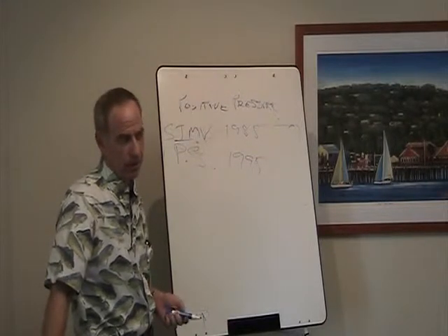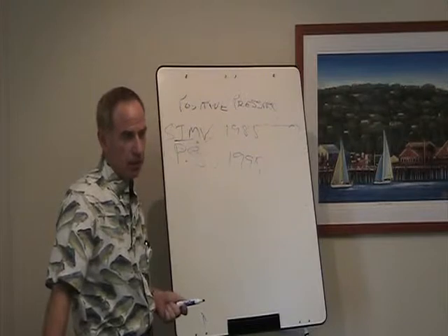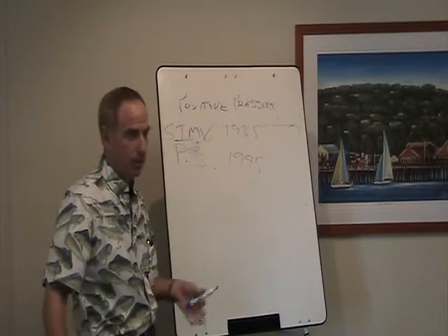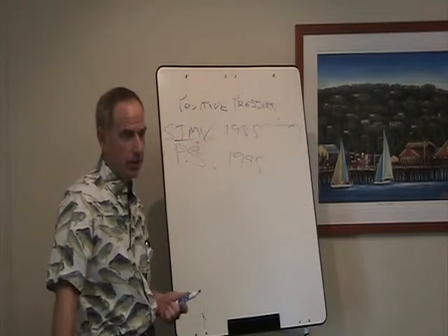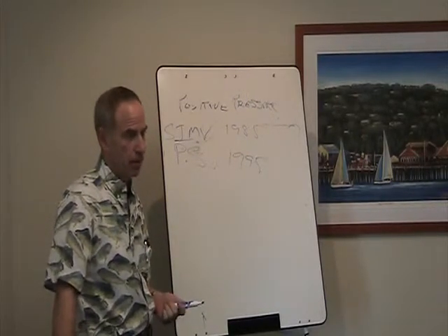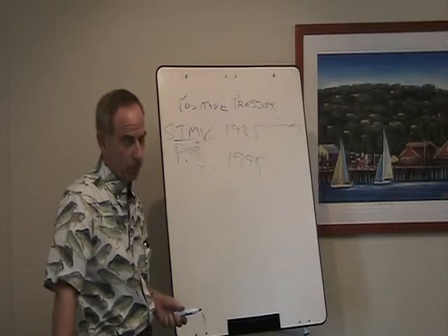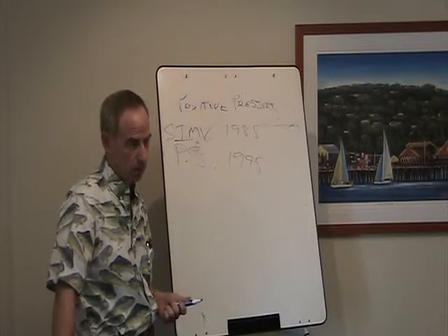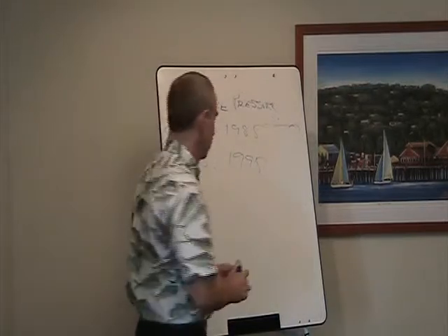Pressure support was developed as a mode of weaning again, just like IMV. It wasn't developed as a mode to ventilate people with as a primary means of ventilation. It was specifically developed as what was thought to be a better way to wean patients from the ventilator. So what is pressure support?